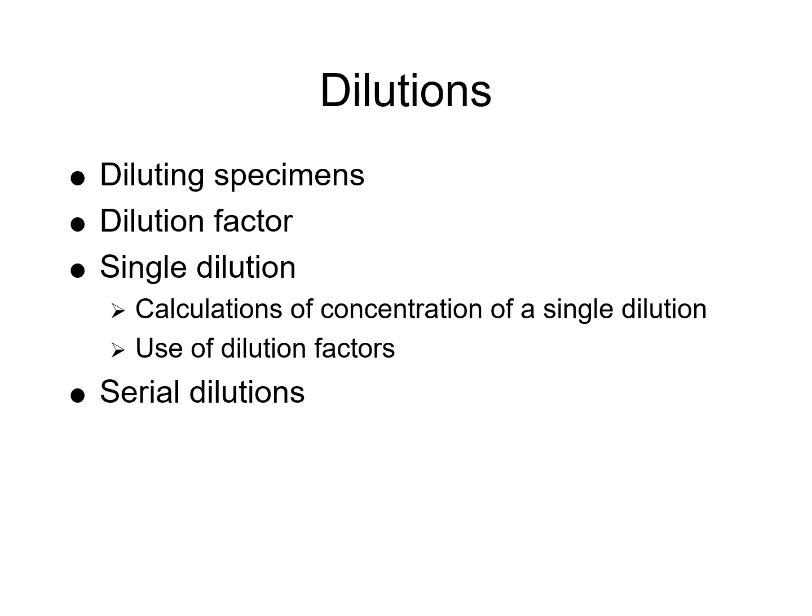The use of dilution factors helps standardize results across different laboratories and assays, and it helps avoid saturation or interference in tests due to high concentrations.